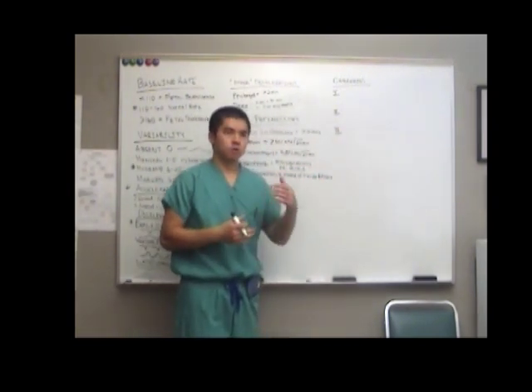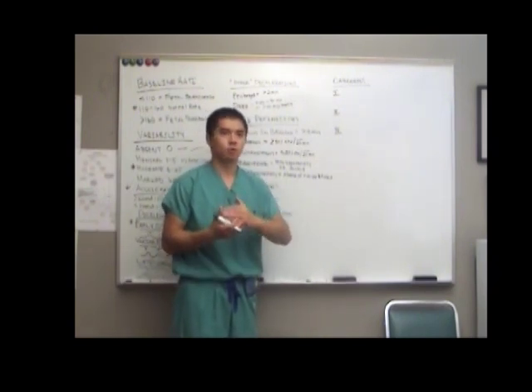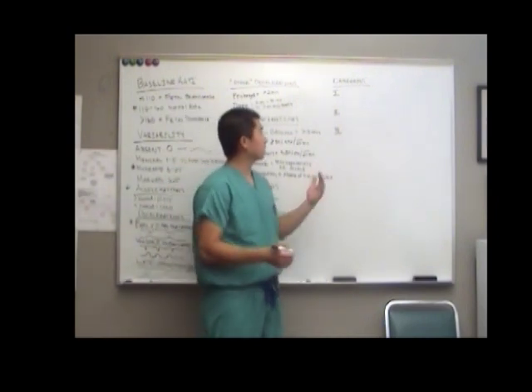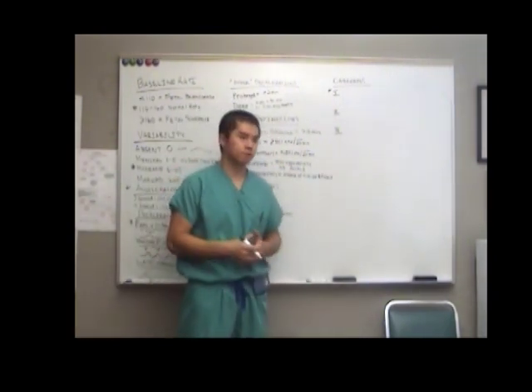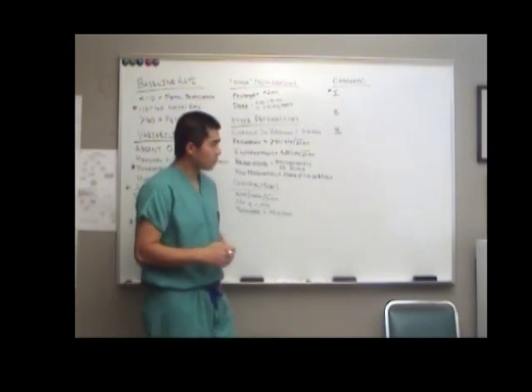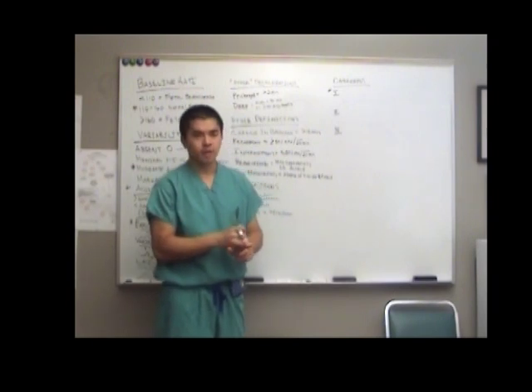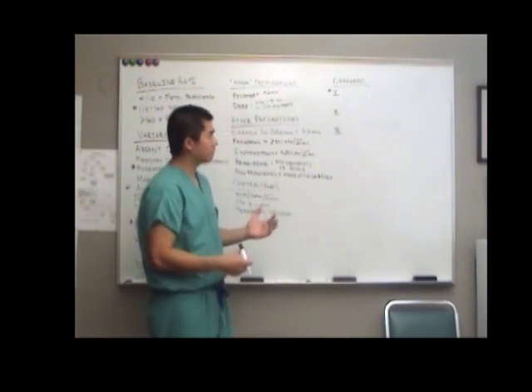So the thing about categories is we know one of them is good, we know one of them is bad, and the other one we have no idea about. So which one is the one that we like? Yeah, category 1 is the one that we like. Okay. Which one is the category that we know is definitely bad? Category 3. That's correct. And so there are strict definitions for category 1 and category 3. So you only have to know the definitions for those 2, and then everything else belongs in what category? Category 2. Okay. So let's start off with category 1.